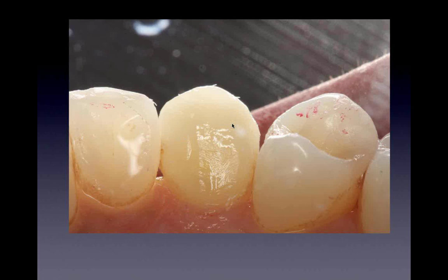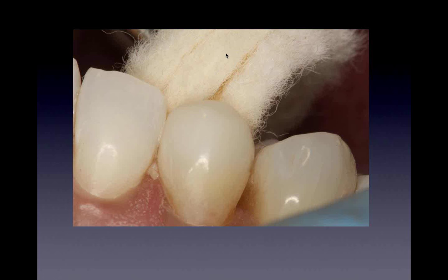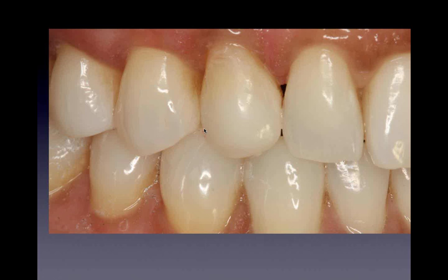Here's the lingual step. So we went all the way around to there. Again, this is polished to a butt joint at this point. It's polished to a butt joint all the way through. We start with our Robinson brush, and we finalize with our paste. We use paste on our slow speed with basically a rag wheel made for a slow speed, and that really gets me the best finish that I've ever been able to get, and we get it to look like that. But the occlusion was really the key point in this canine treatment.